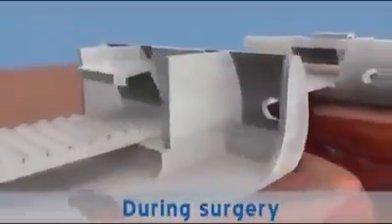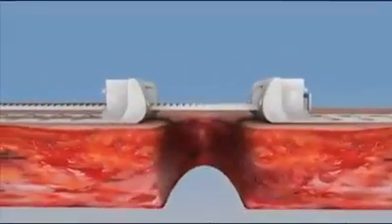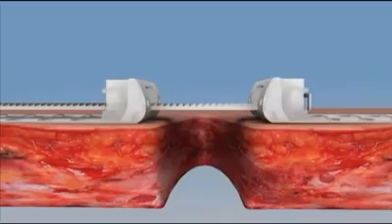The strap is inserted through the lock-release mechanism of one plate to the far plate. Here, the system is used for the gradual approximation of wound edges when the edges are under significant tension, preventing primary closure.